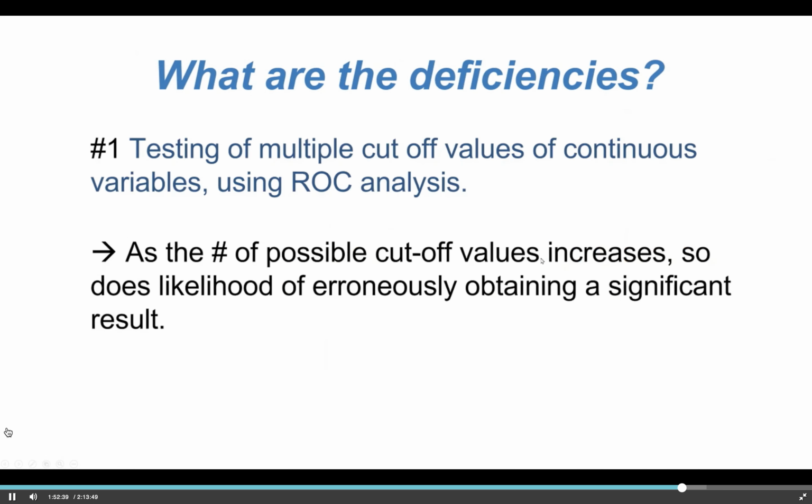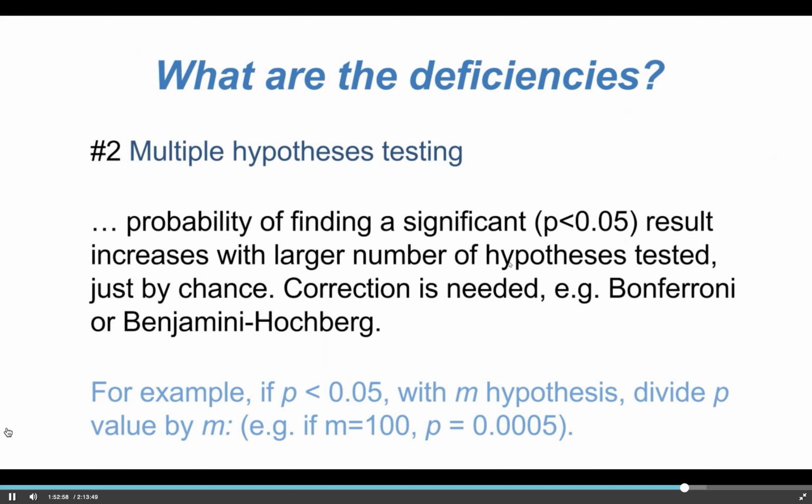The idea of overfitting is that when you have so many features, when you throw so many variables at your prediction model, the chances of finding something significant statistically by chance increases. And so this is one of the biggest pitfalls that you absolutely have to be aware of. And when you read a paper, definitely pay attention to this.